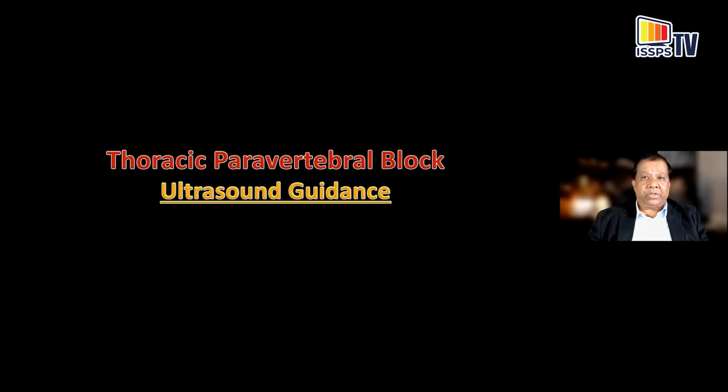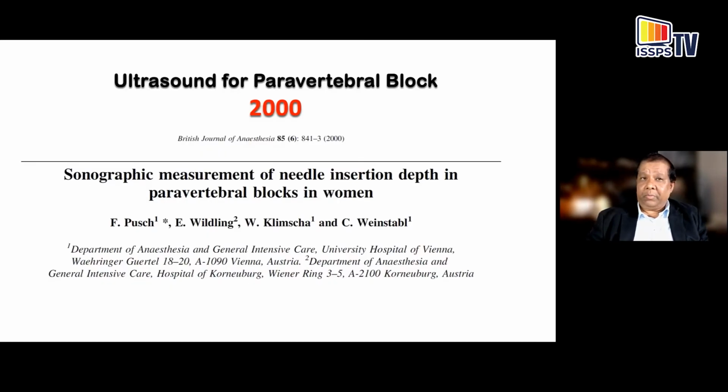So today, ultrasound is common. In fact, the first report of using ultrasound for paravertebral blocks was not using it to guide needles. It was used by a group from Austria to measure the depth to the paravertebral space and then do the usual landmark technique in 2000.